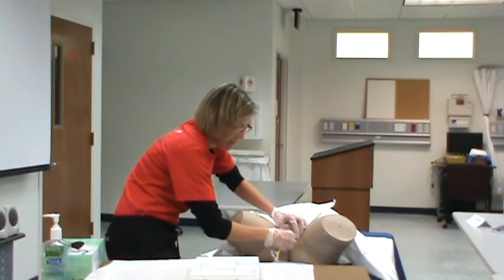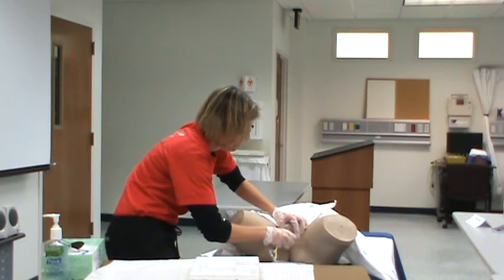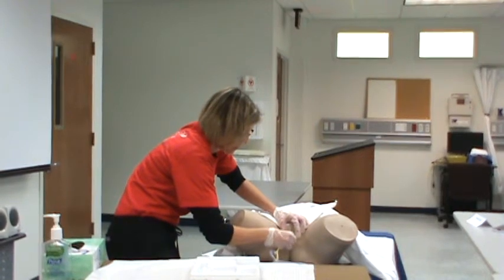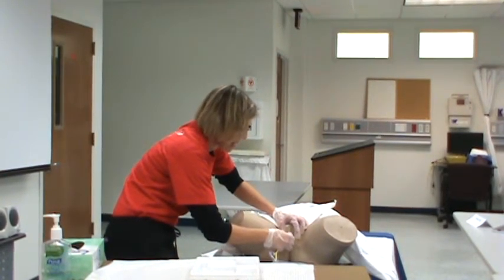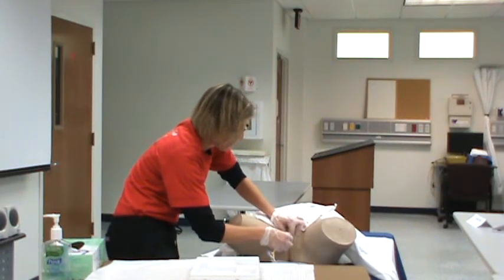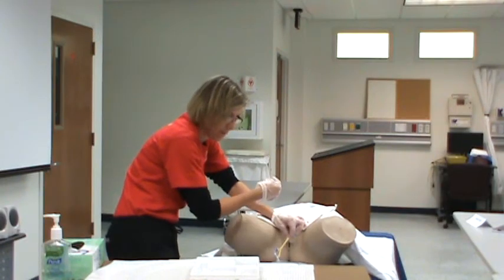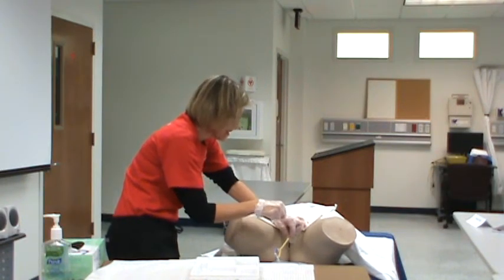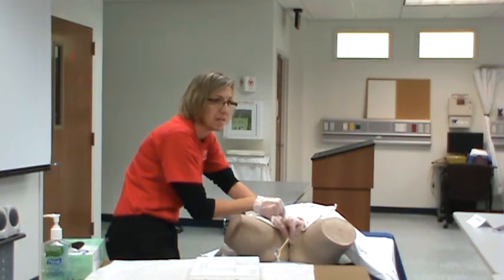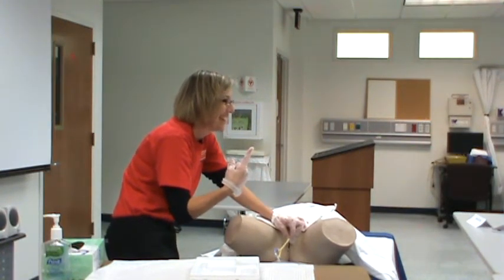Okay. When we see urine, you go, what does the book tell you? How much further? 2 more inches. Mm-hmm. So I'm going to go a little bit further with her. And then I take my contaminated, but not sterile, but clean hand basically, and I hold my catheter. This part of the catheter is not going into Mrs. Smith, so you can stabilize it. In fact, you need to stabilize it. If you don't stabilize it, it's going to come flying back out. You'll only do that once, okay?